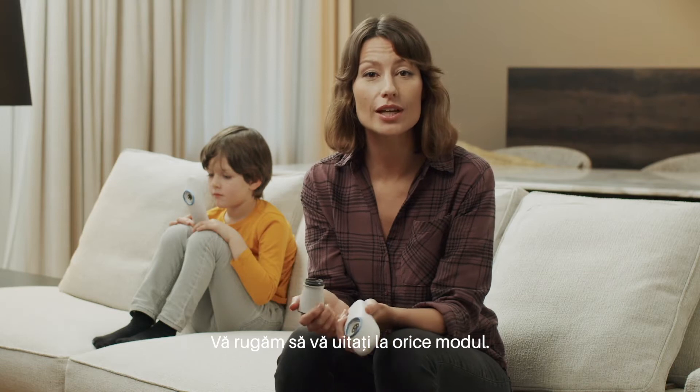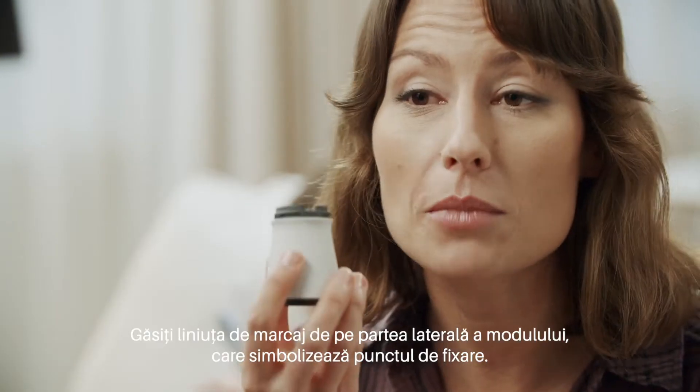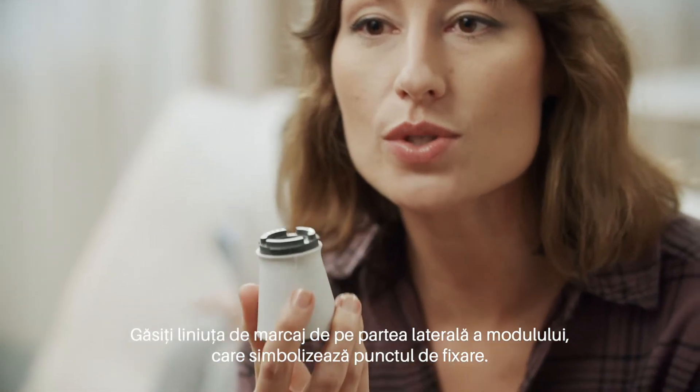Please have a look at any module. Find the marker line on the side of the module that shows the mounting location.